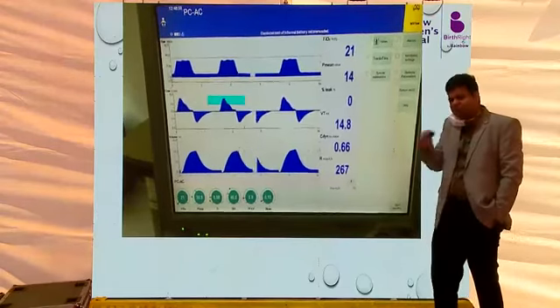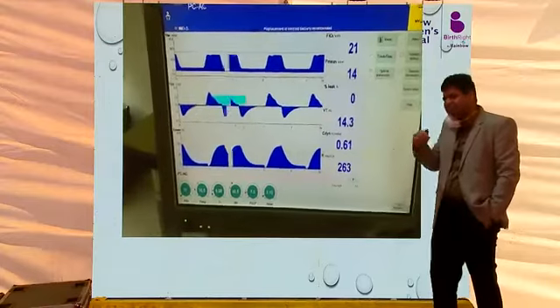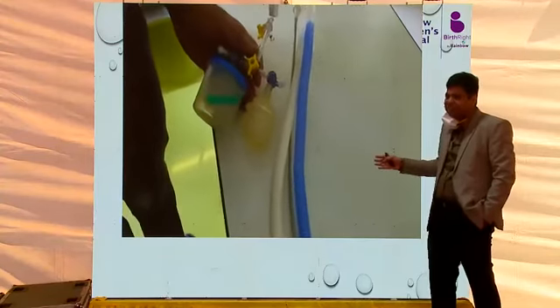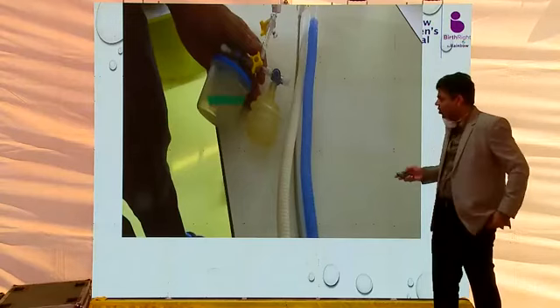So on your nursing monitoring sheet, it is actually important if the nurse is mentioning the compliance. When you come and the child is desaturating, look for the compliance. If it has decreased, you can think, okay, collapse has happened, or pneumothorax has happened.